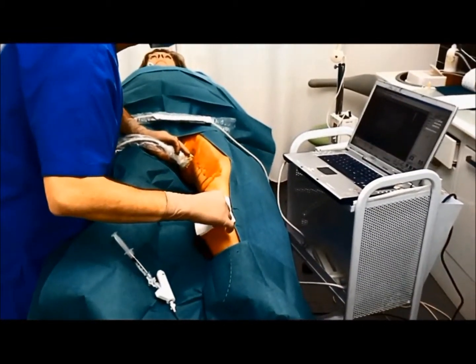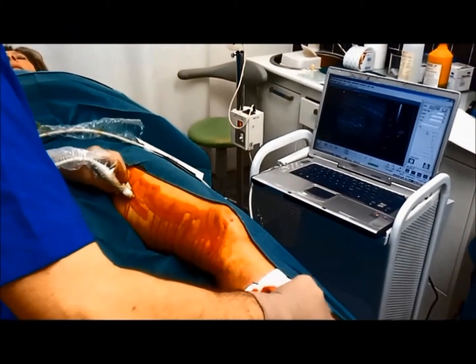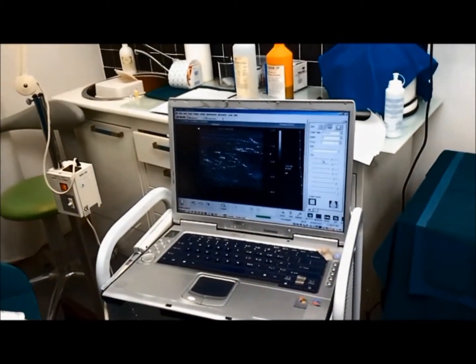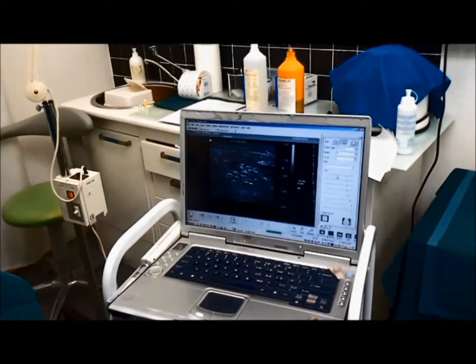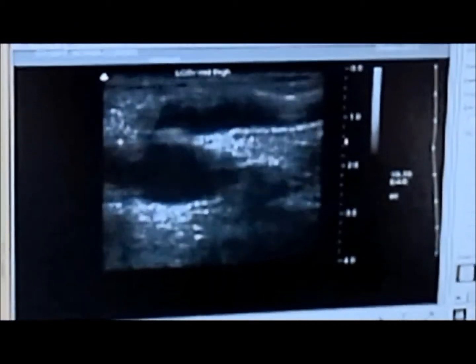The catheter is placed through the sheath and pushed up to the sapheno-femoral junction under ultrasound guidance. The wire tip is positioned 2 cm from the sapheno-femoral junction. Wire rotation is activated for 2-3 seconds prior to starting the infusion of the sclerosant agent.